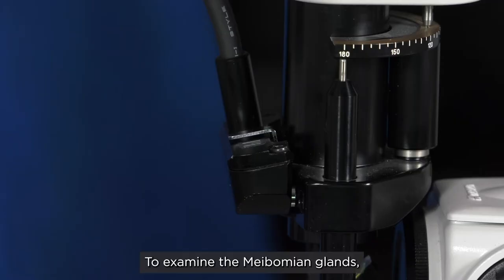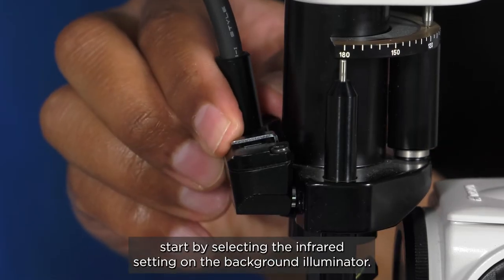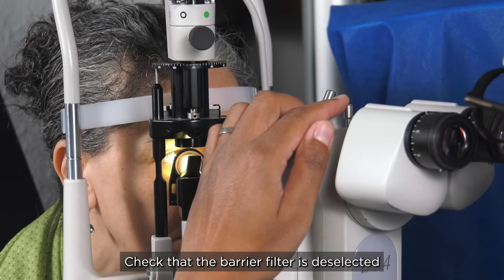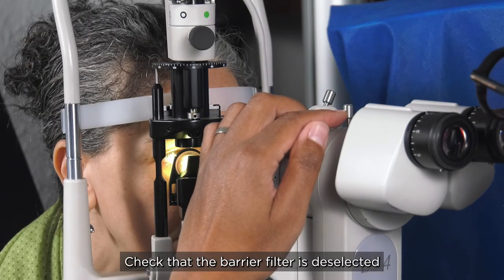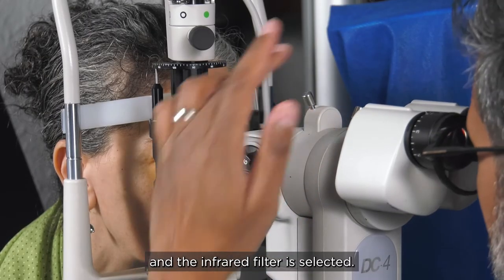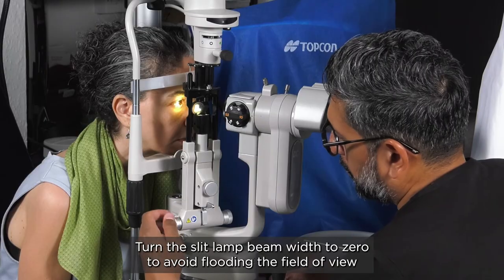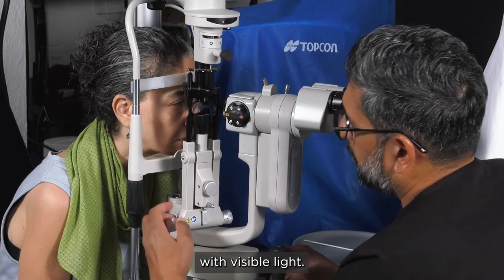To examine the meibomian glands, start by selecting the infrared setting on the background illuminator. Check that the barrier filter is deselected and the infrared filter is selected. Turn the slit lamp beam width to zero to avoid flooding the field of view with visible light.